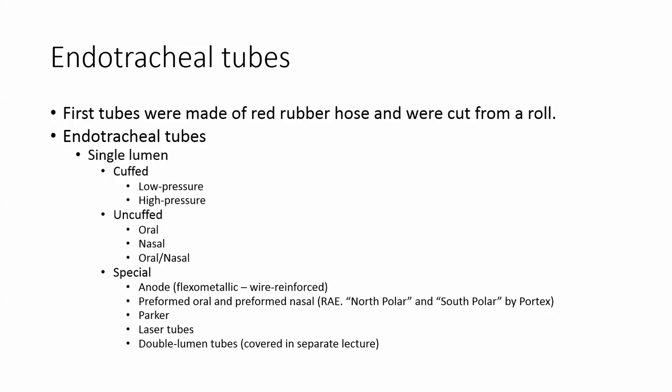There are tubes which are laser resistant or laser proof, and which are used to provide anesthesia in the presence of laser beams. And of course, all these tubes have recommended instructions for use, and sometimes they're not entirely intuitive.